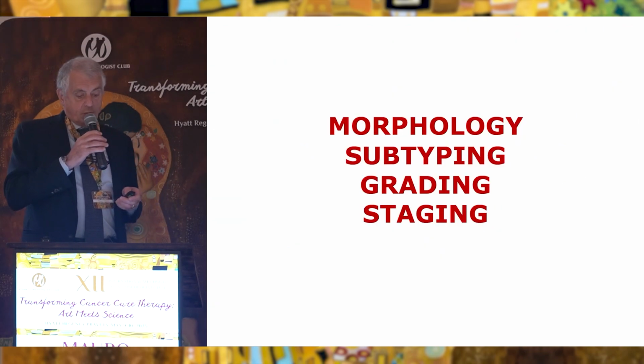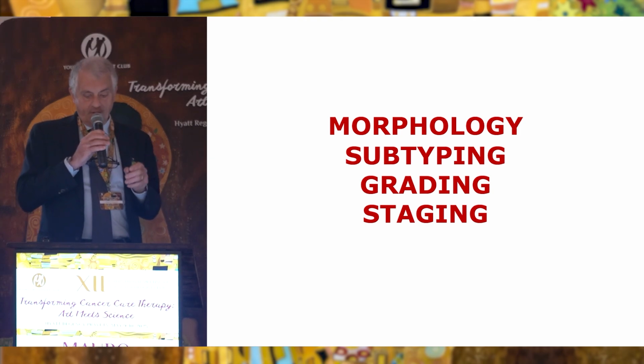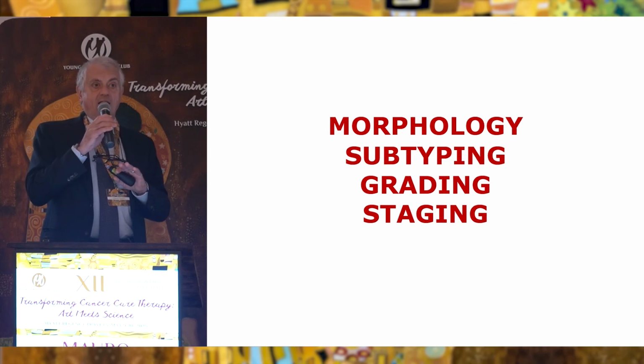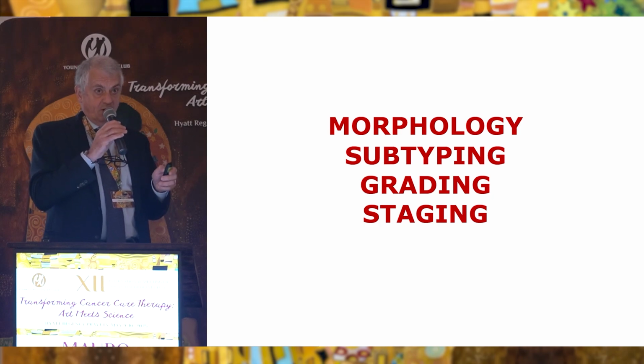First of all, morphology, subtyping, grading, regular microscope work, which has not yet been replaced by any deep learning, artificial intelligence or anything. Maybe in the future, but I'm going to retire, so I will not see it.